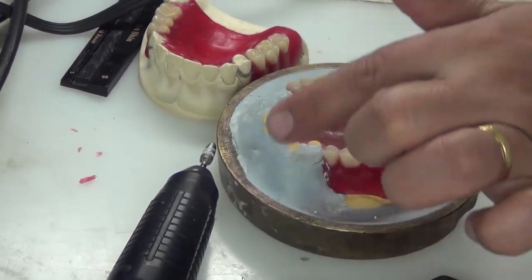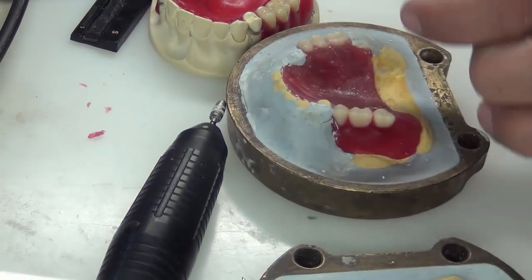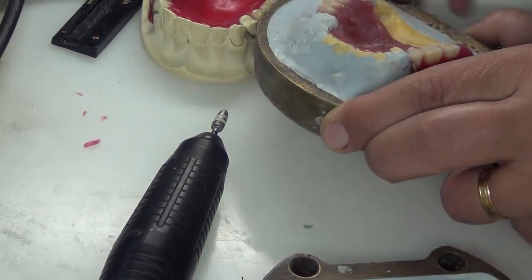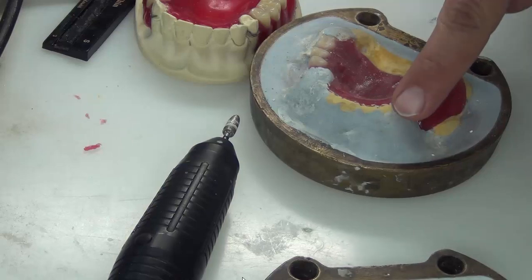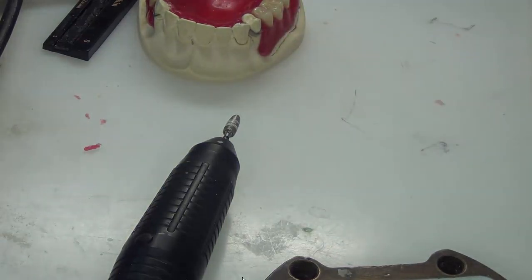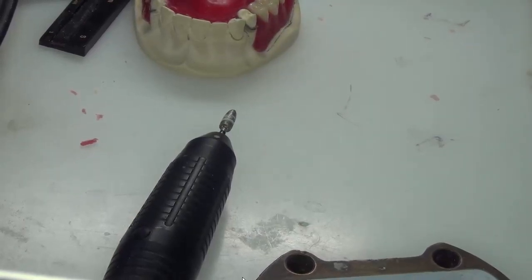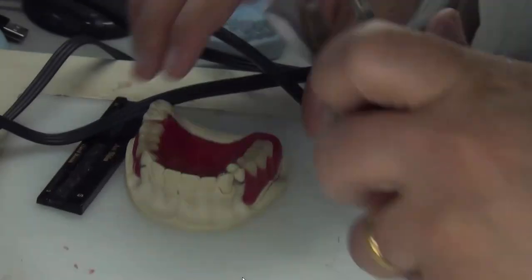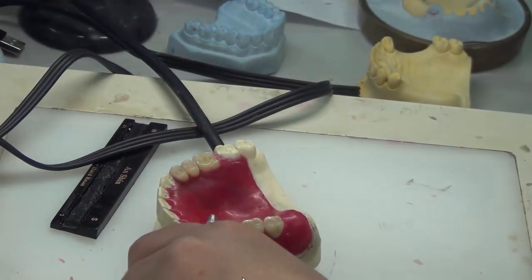So once we cut them off, what we will have in these areas are smooth surfaces that can allow us to separate the denture easily when it becomes hard later on. So we cut them in an inclined form. So they are all inclined buccally. So the cut is inclined in this direction, okay? Buccally. So with the bur, you can notice the procedure. All natural teeth, I'm going to cut them away. And I'm inclining the bur buccally, okay?